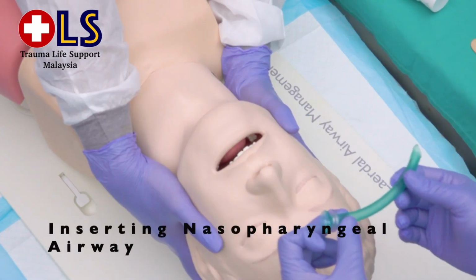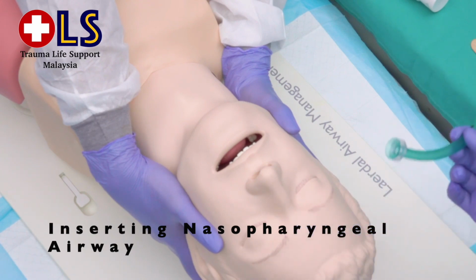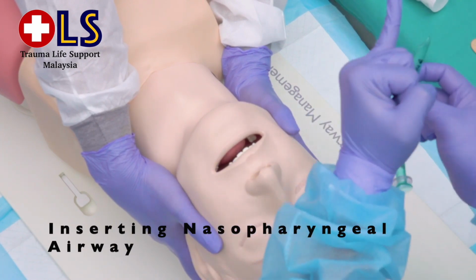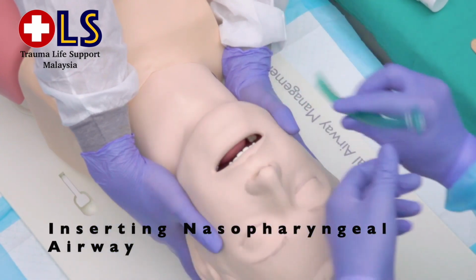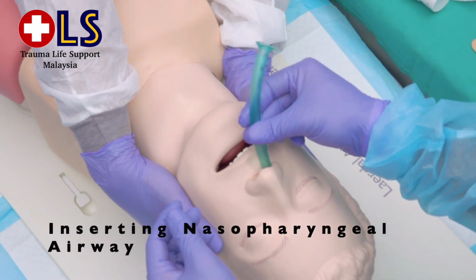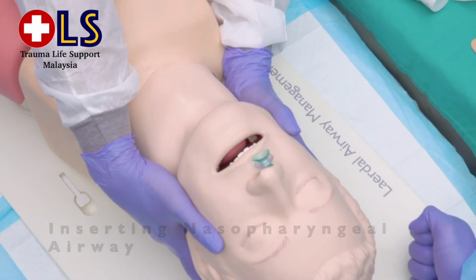If your patient has a gag reflex, we cannot insert an oropharyngeal airway, therefore we will insert a nasopharyngeal airway. First, we need to measure from the tip of the nose until your earlobe. Or your other method of measurement is with the patient's little finger. Insert it gently, apply gel. Insert it gently through your nostrils and with gentle twisting movements, slowly insert it until its maximum.